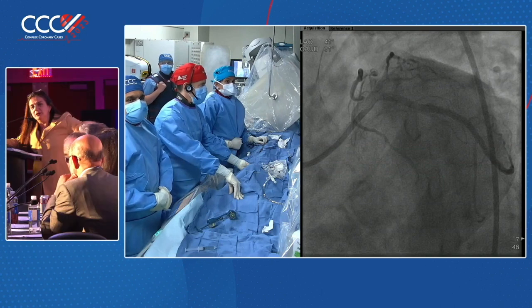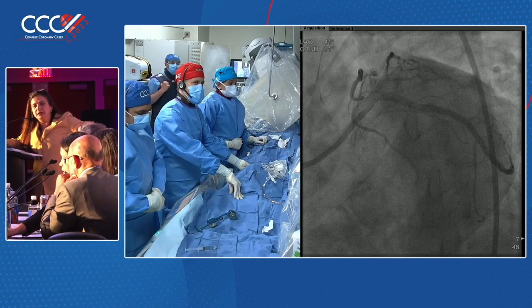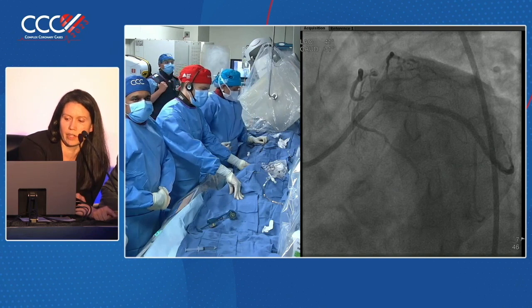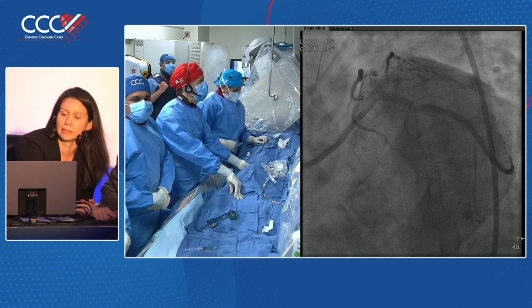And LAD diagonal, you're okay with the mini crush, or do you like the DK crush? What do you like? Yeah, I think DK's handy and it's good for training just to get comfortable with the steps. Ultimately, they're very similar, but since you have the diag protected, reaccessing that is going to be easier. And there's not enough calcium here that I think it would make too much difference either way.